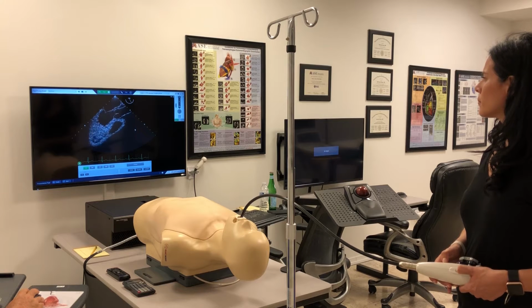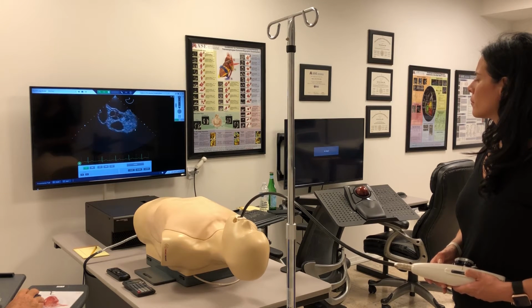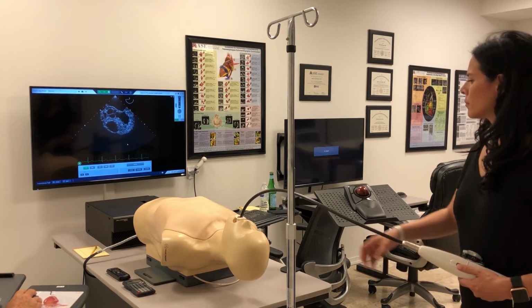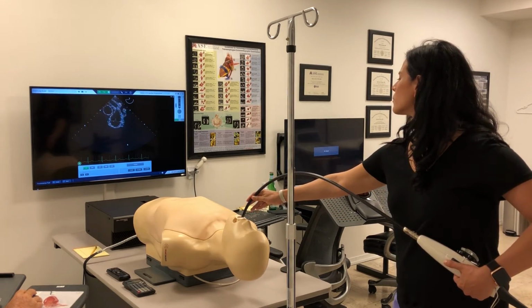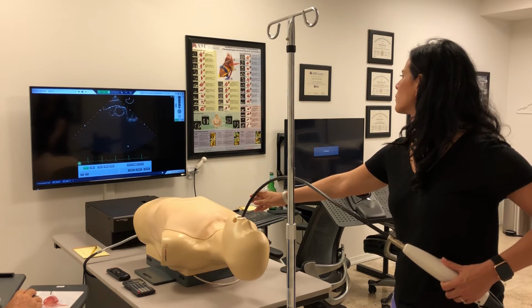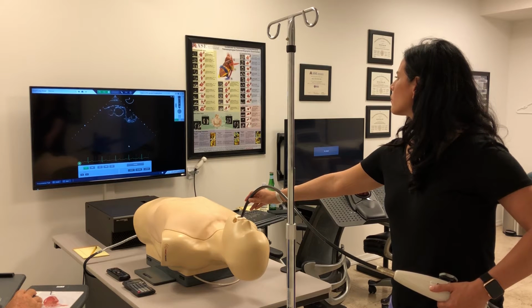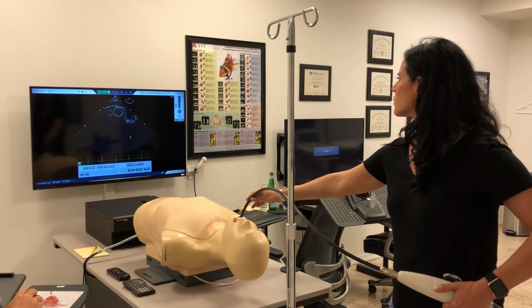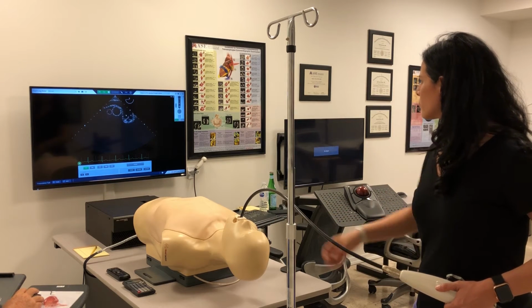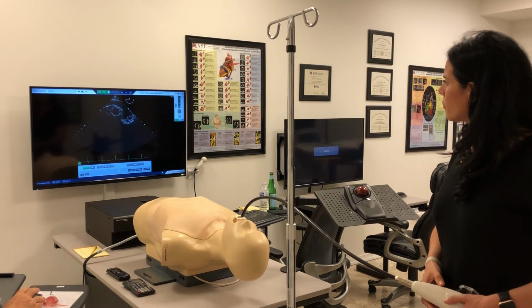The next view is going to be a trip up the ascending aorta. So let's return to 0 degrees of omniplane. And simply withdraw the probe until we see the perfect triad of ascending aorta in short axis, main pulmonary artery, and superior vena cava. So you want to rotate the probe so you see all three clearly. There we go. Maybe even a little bit more rotation just to see this part of the main pulmonary artery right here. There we go.